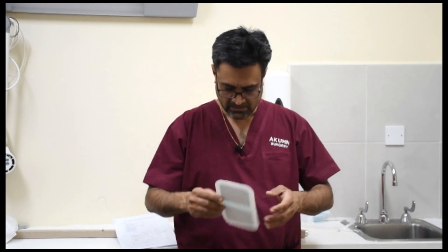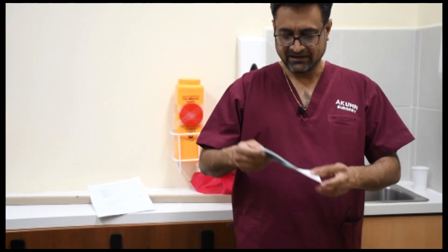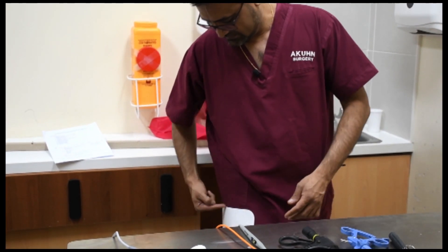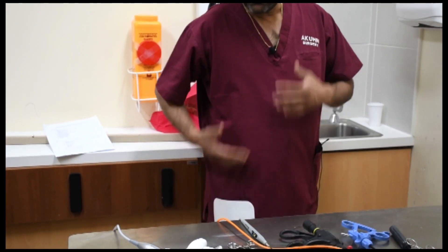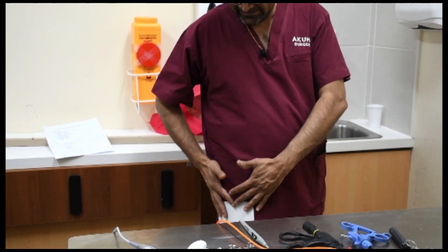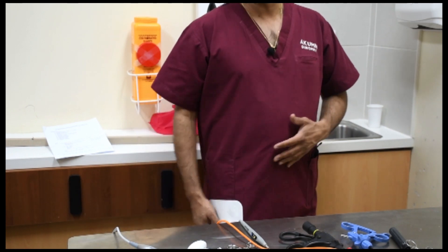The second thing — remember the rule: thin in, thin out, burn. Thin in, broad out, no burn. So try and make sure you always have a broad out, not a thin out. When you apply the electrode, you have to apply it so that the broad surface is close to the site of surgery. So when you operate here, the current will go and disperse there, and there'll be no burns.